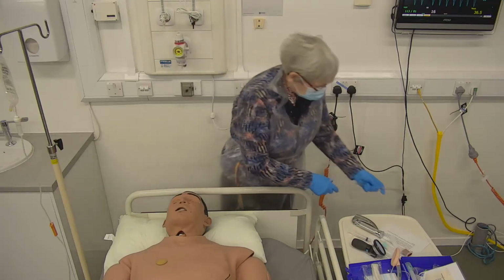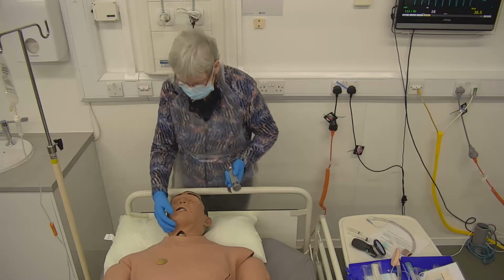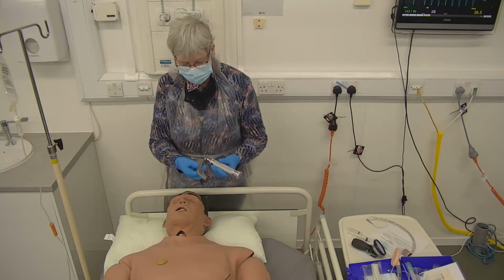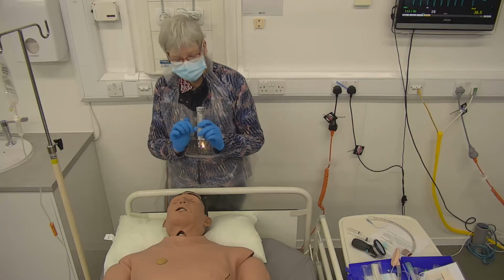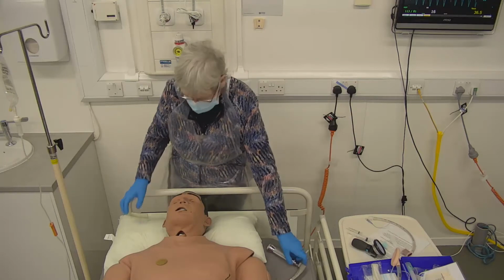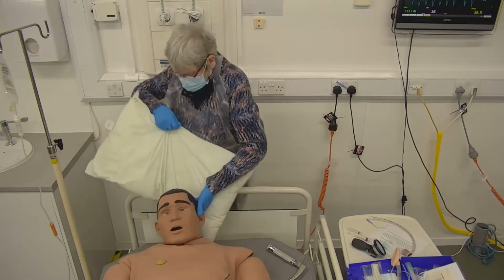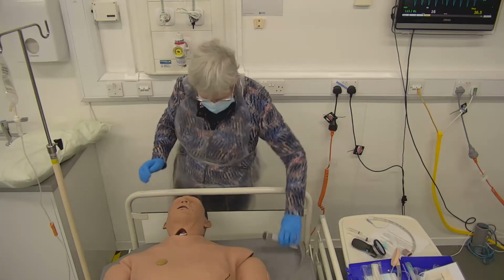So what happens in theatre or in an ITU situation, in order to put that tube into somebody, you use something called a laryngoscope, and this is one, and you can see here that there's a little light at the end. So what I need to do is have the head extended, so I might just remove that pillow. Normally he'd be a little bit flatter, but actually for the purposes of this, so that you can see what I'm doing, I've raised him a little.